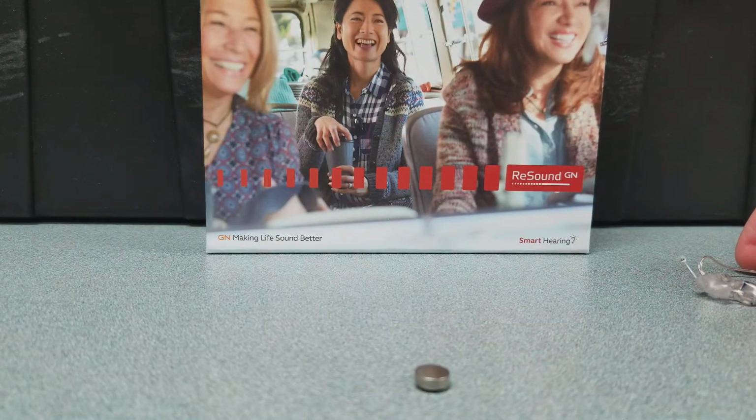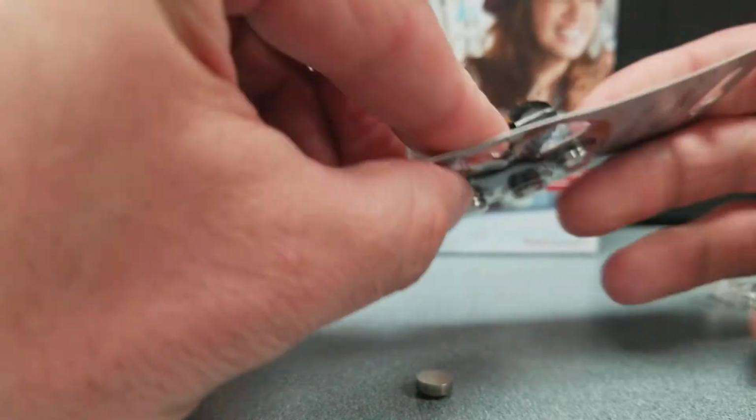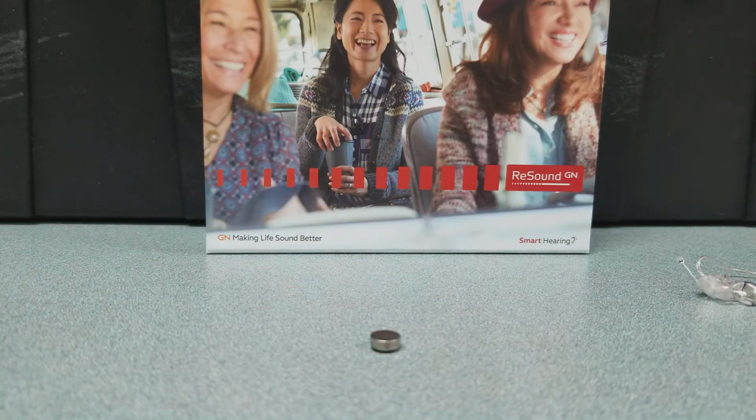Your batteries are air activated. To get them out of the package, you're going to push through. You're going to notice that the battery is affixed to a sticker. You're going to remove it from the sticker, wipe the flat side off with a tissue, and then we want you to let it sit for 5 to 7 minutes. The reason why we do this is that the batteries are air activated and they need about that amount of time to breathe to get up to full strength.